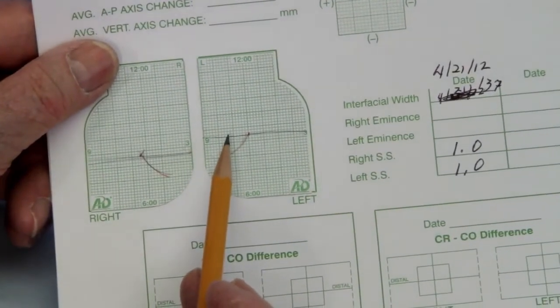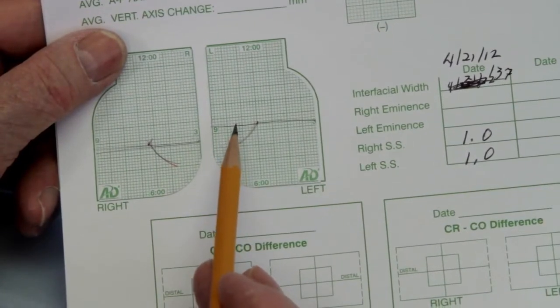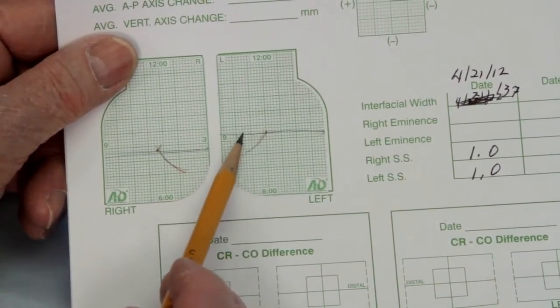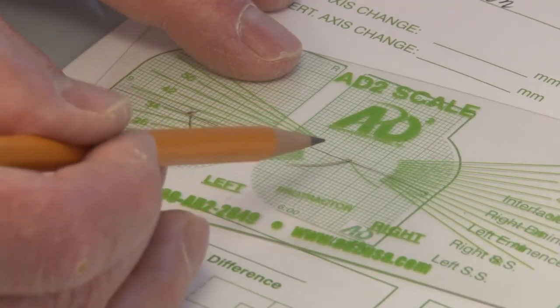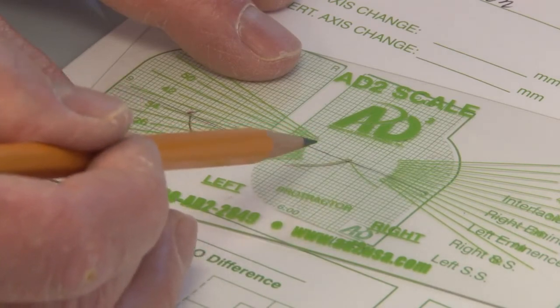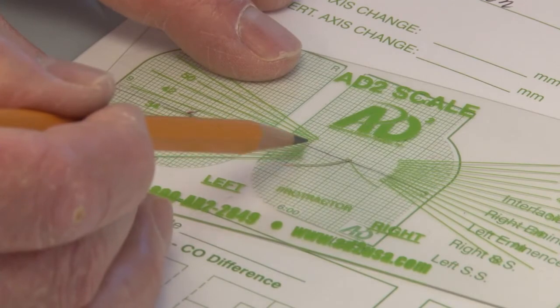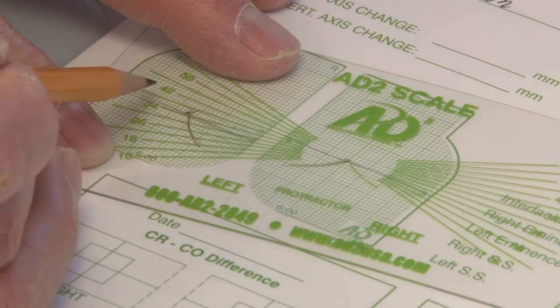Now the angle of the eminence is actually the measurement of this space between the axis orbital plane and the actual recording of the patient. So I'm going to use the graph I just showed you to establish and measure the angle of the eminence. Now I've superimposed this point on the hinge axis point on the flag, and I've superimposed the 6 or 7 millimeters of the curvature on the graph paper on the patient's tracing. And then I'll project the axis orbital plane across to here, and you see the axis orbital plane actually lines up with this line right here.